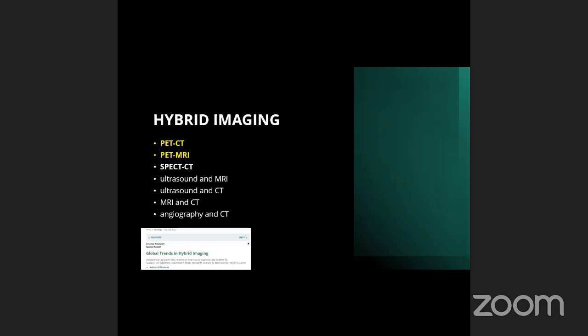This started a long time ago, even between MRI and CT, between ultrasound and MRI, between whatever two modalities, so you can get the benefit. Right now it has become more and more advanced. Many tracers are used in PET CT, PET MRI, and SPECT CT as well.